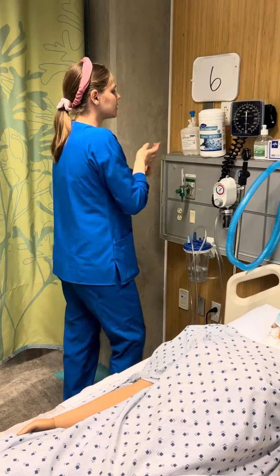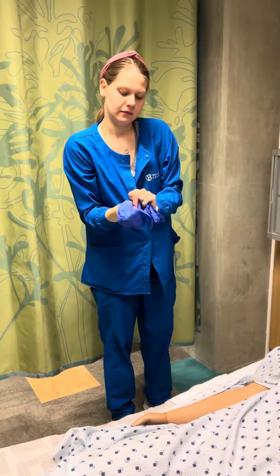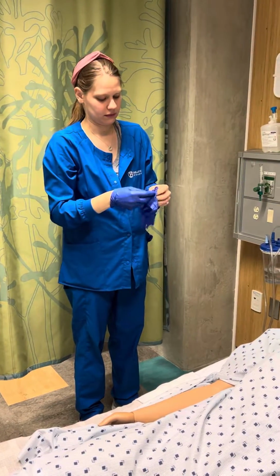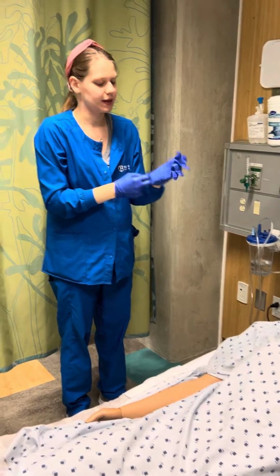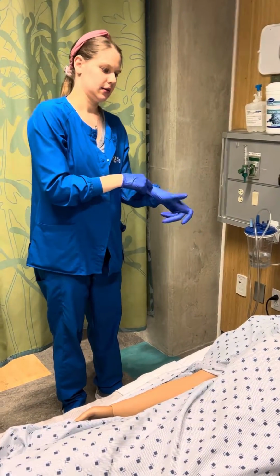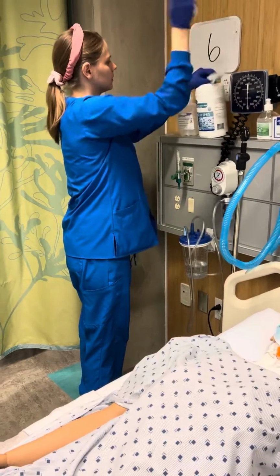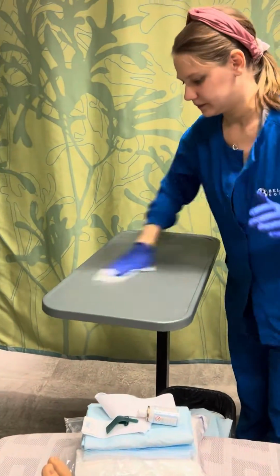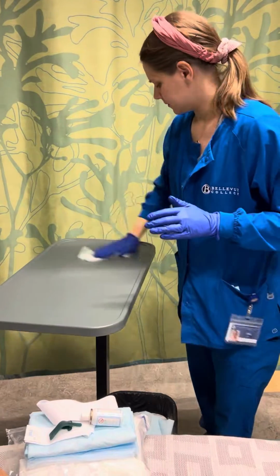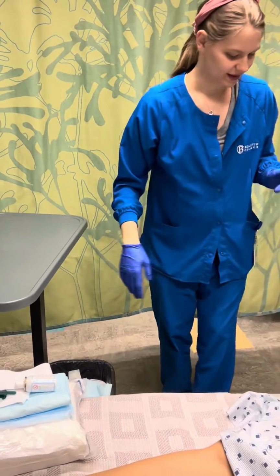So I perform hand hygiene. I'm going to put on non-sterile gloves. And do you have any allergies to latex or betadine or anything else? No, she doesn't. Fantastic. And I'm just going to clean my surface. Okay. And I let my surface dry completely.